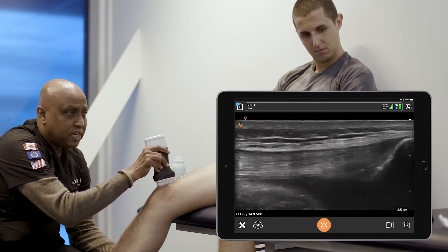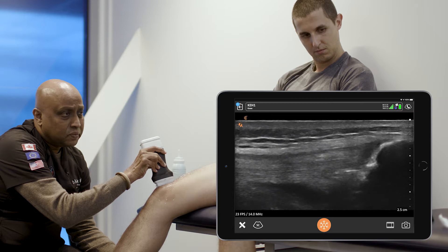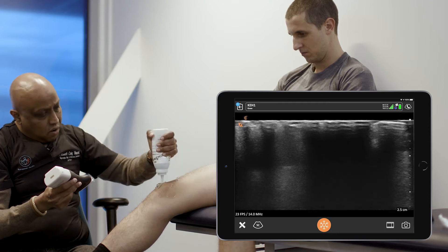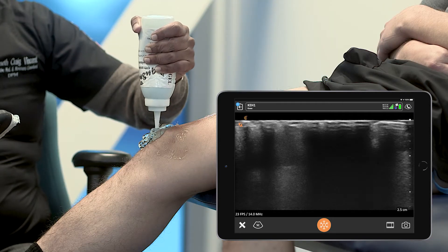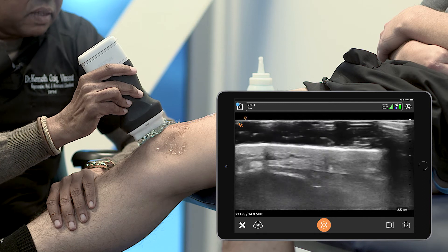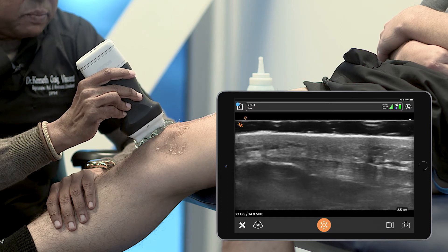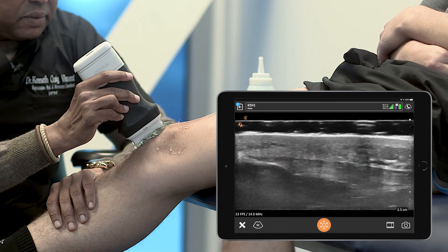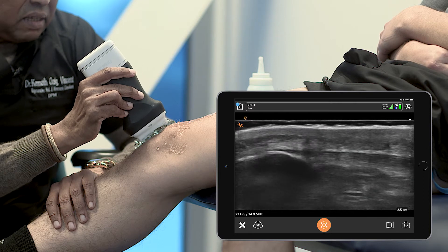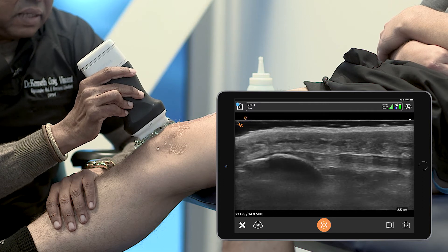Physiological changes are present. Going laterally — nothing of concern. From here, I'm going to scan the superficial space of the patella itself, using the floating technique — no contact. We can nicely appreciate the gel space, which is superficial, and the hyper-echoic structures of the patella. There's no sign of pathological bursitis occurring after half an hour of load on ice.